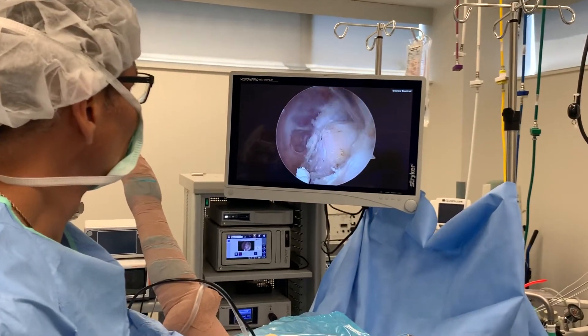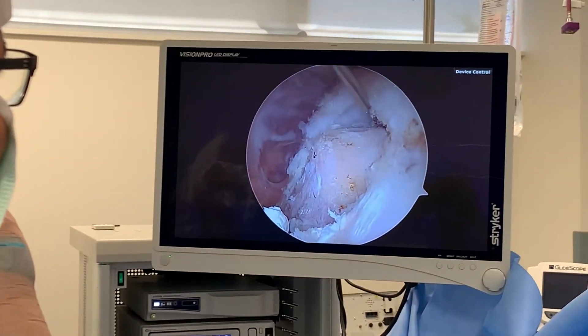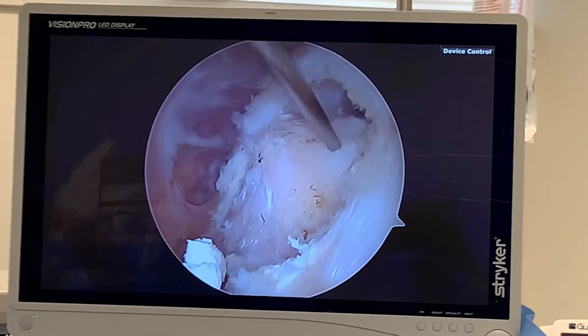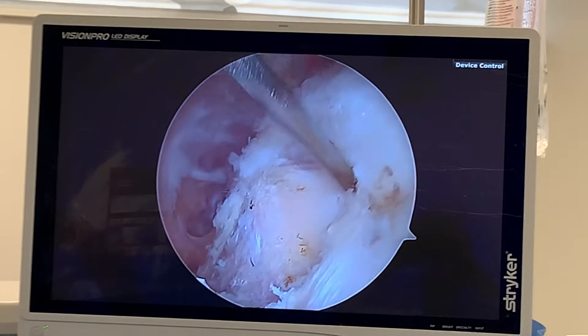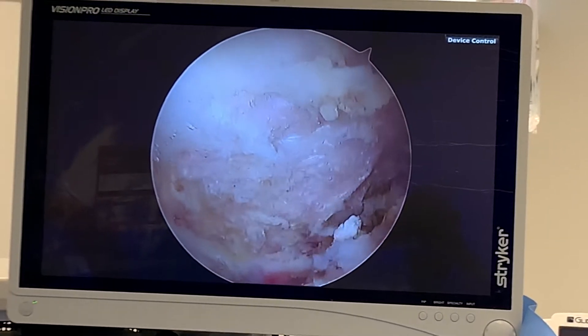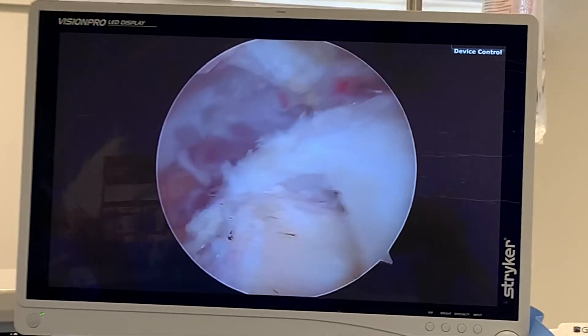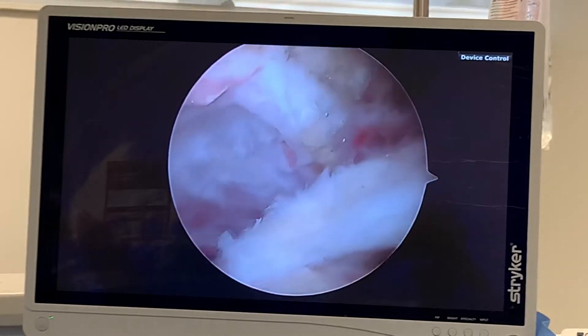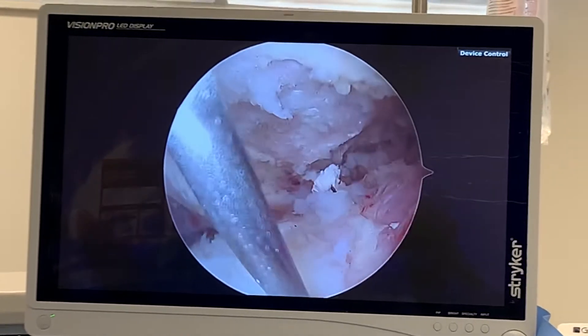That's what this crescent shape opening is right over here. Greater tuberosity, rotator cuff tear. I'm on top of the rotator cuff. The acromion bone is above, and the deltoids would be to my left. So we are inside the shoulder.